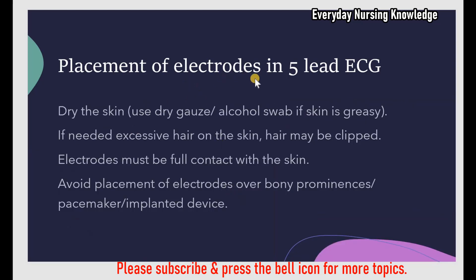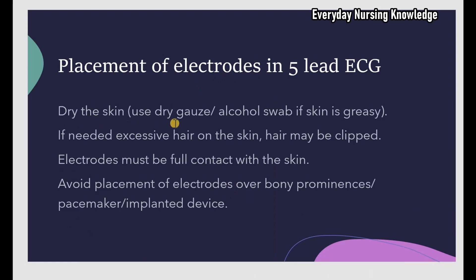Before placing the electrodes, make sure the skin is dry. You can use a dry gauze to clean the skin, or an alcohol swab if the skin is oily or greasy. If you are using an alcohol swab, let the skin dry before placing the electrodes.